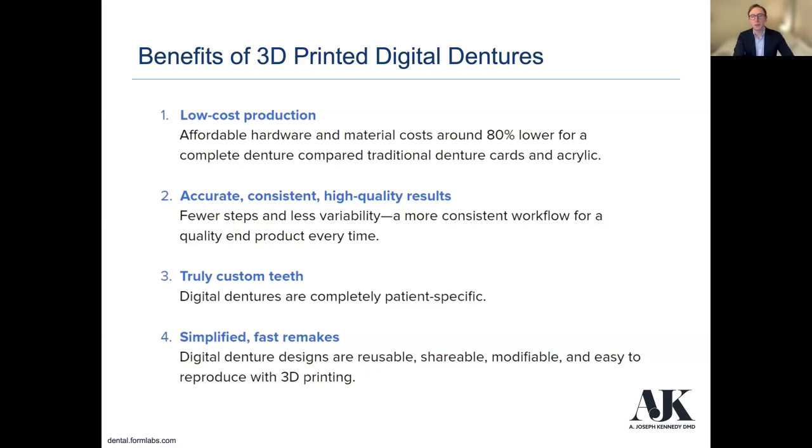Now, again, you can use your traditional denture teeth, or you can just use the design software to use whatever type of teeth that you want to add to it, which is just fine too. But I thought that was a pretty neat way to think about it.